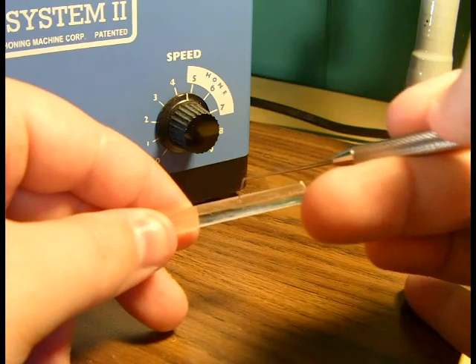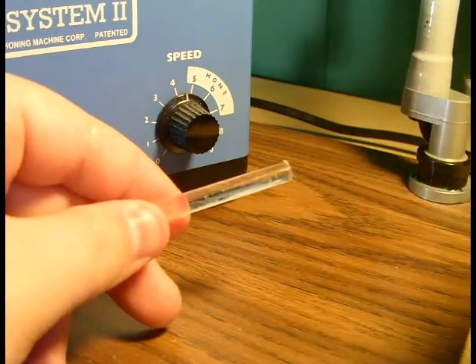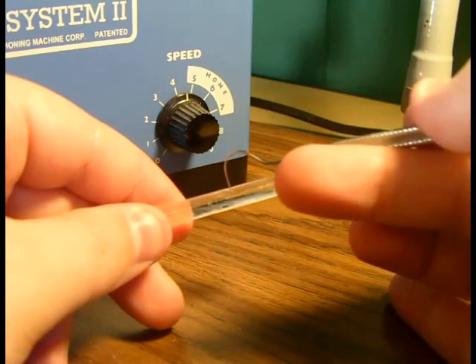Like the other instruments, we're going to test the Explorer. We want to make sure that the Explorer grabs that plastic, not scratches it, but grabs it.